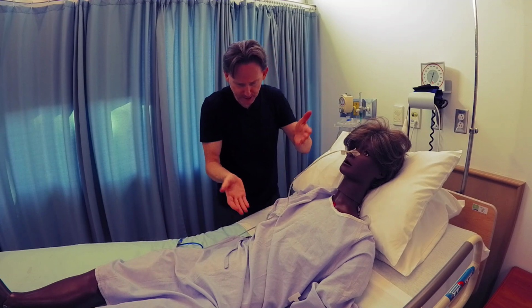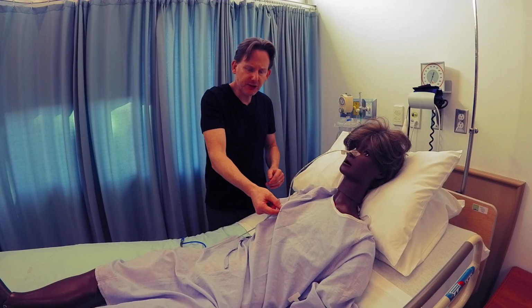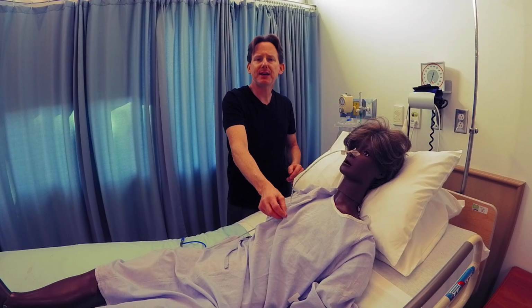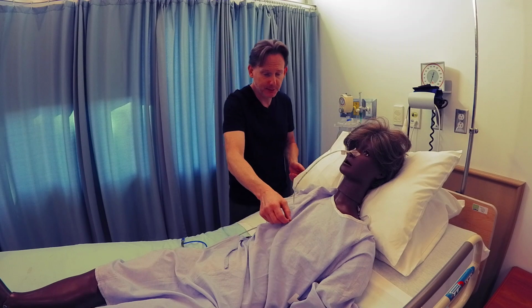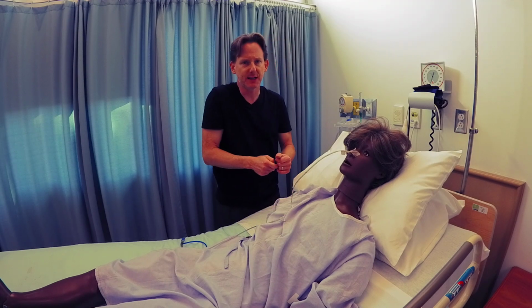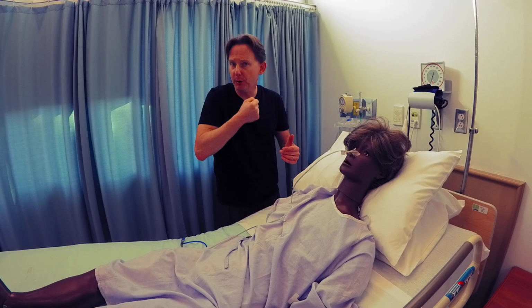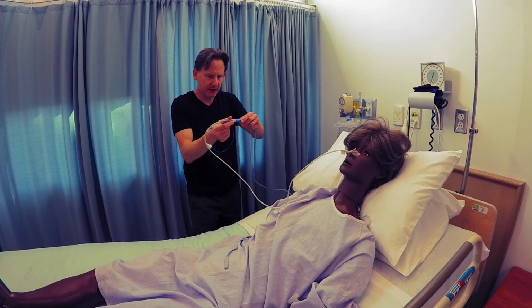Next, you're looking at the tubing to see if anything's flowing, making sure there are no kinks, of course, and that it's pinned to the gown in such a way that the patient can turn their head both ways. Sometimes I've come into the room and I've seen these pinned in a way where the patient can't turn their head, so I'll just move it up and adjust it so they can turn freely without pulling on the NG system. Then you're looking at where it's attached to suction, looks good.